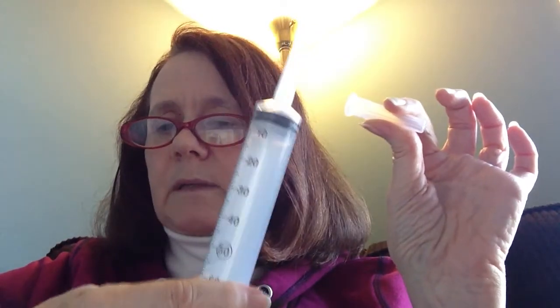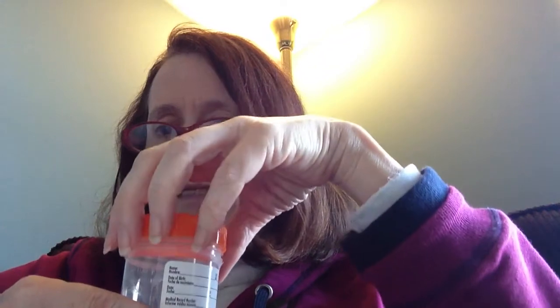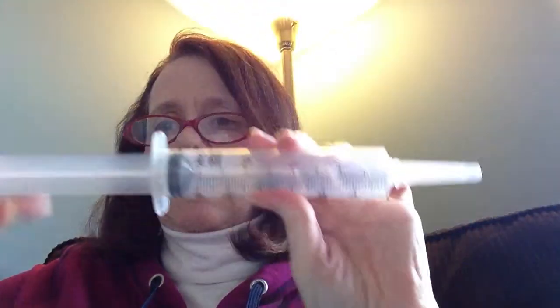You can get smaller, but then what you do is you unscrew the cap. You have mixed the cocktail, and in between each ingredient I always just would loosely set the top on as I prepared the next ingredient. Then you will take the lid off, you will put the syringe in, and you will pull back on the plunger until all the liquid is filled in the syringe. Then I usually cap it and set it aside, because then I need to prepare to catheterize myself.